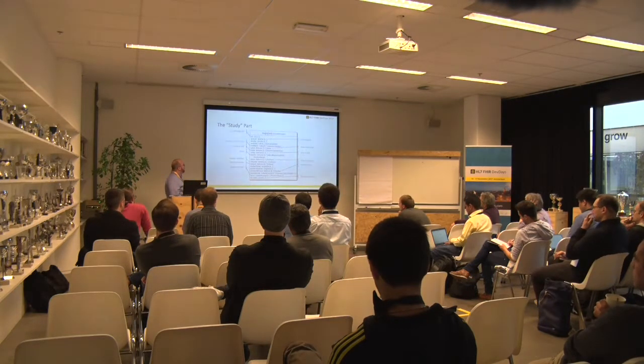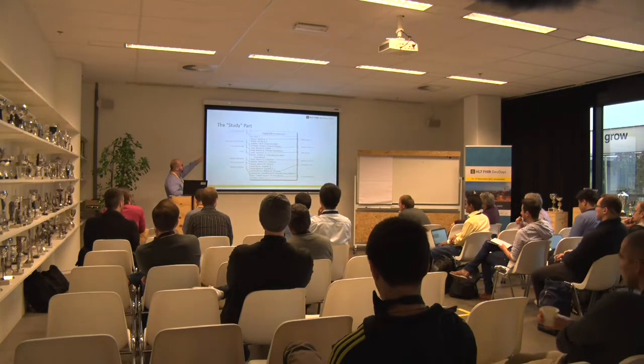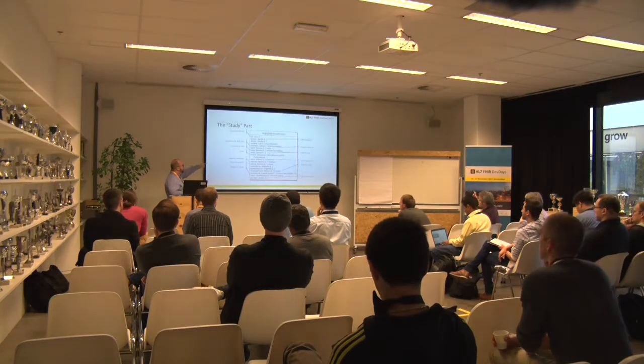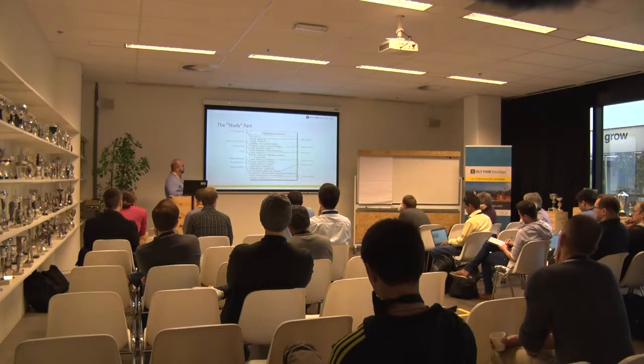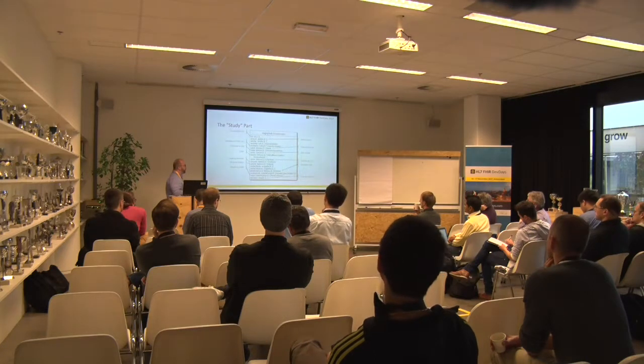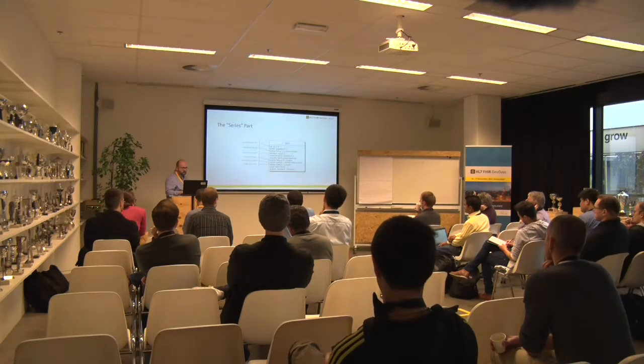So looking at the base instance, you can see that we've got the study instance UID, the list of modalities, whether it's CT or MRI, the account or visit reference, the order that it was based on, who read the study, where to go get the study, why the study was performed, the accession number, obviously the patient and timestamps, who ordered the exam, the type of procedure it was, and then we also have a free text description of what the exam was.